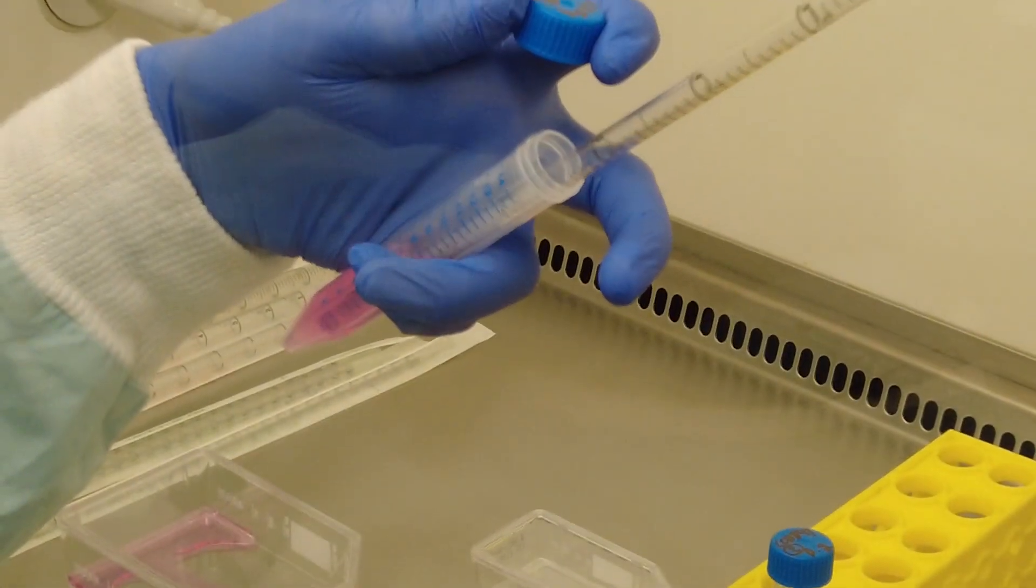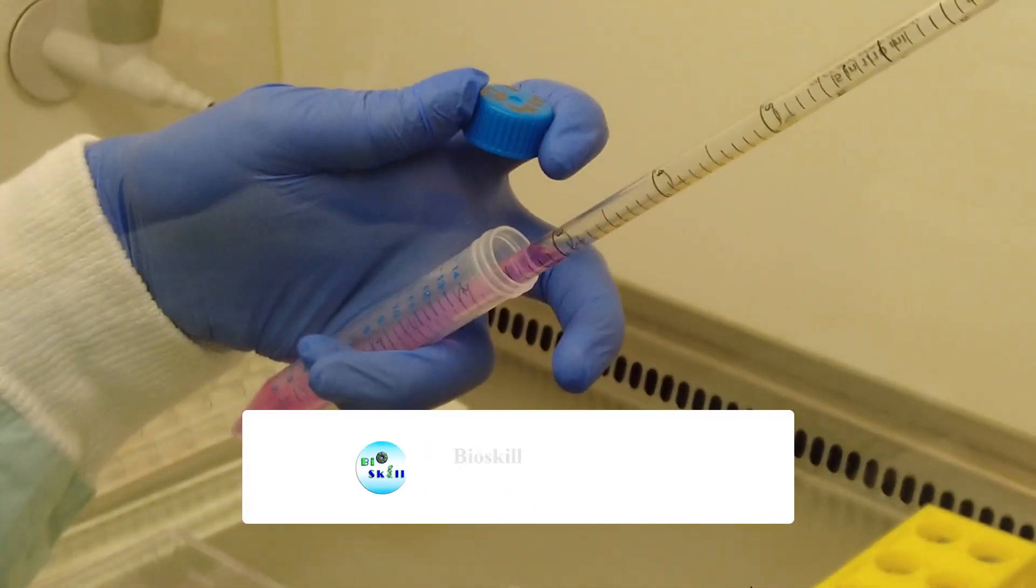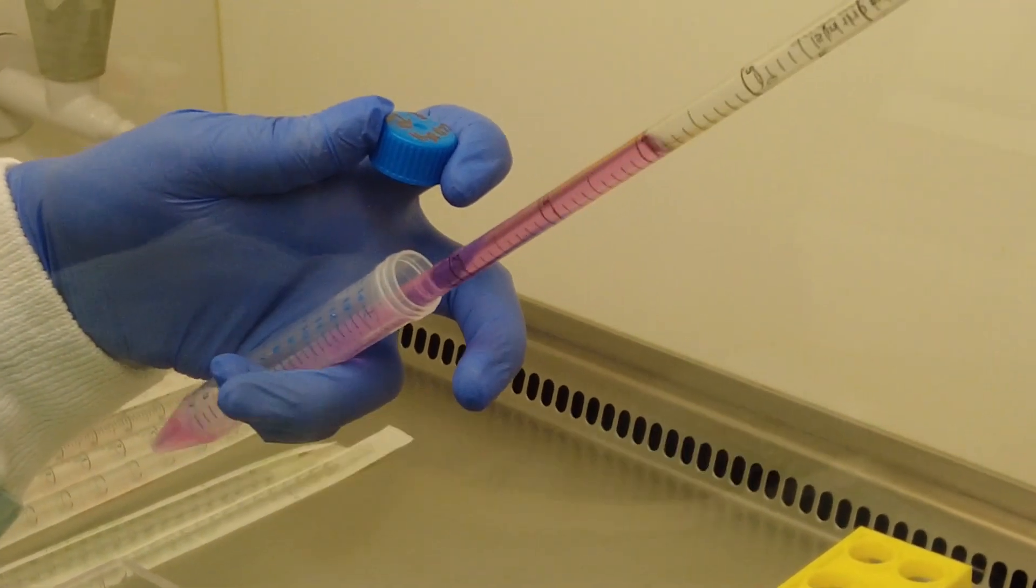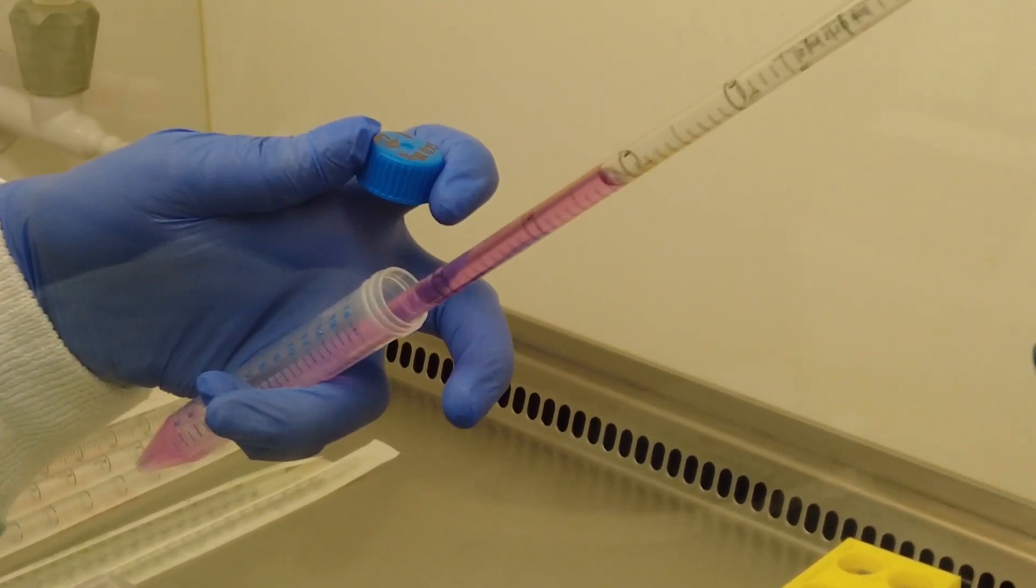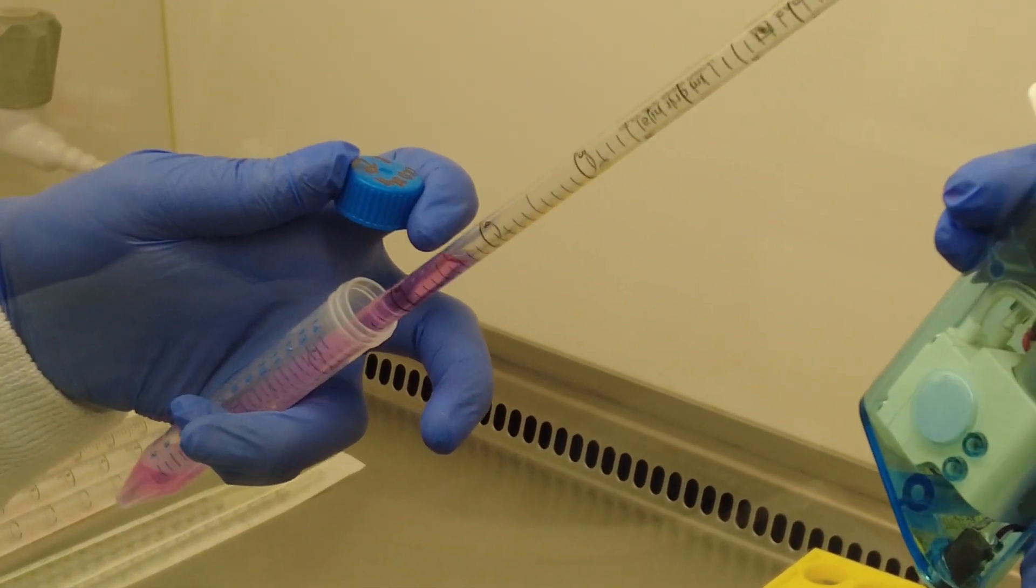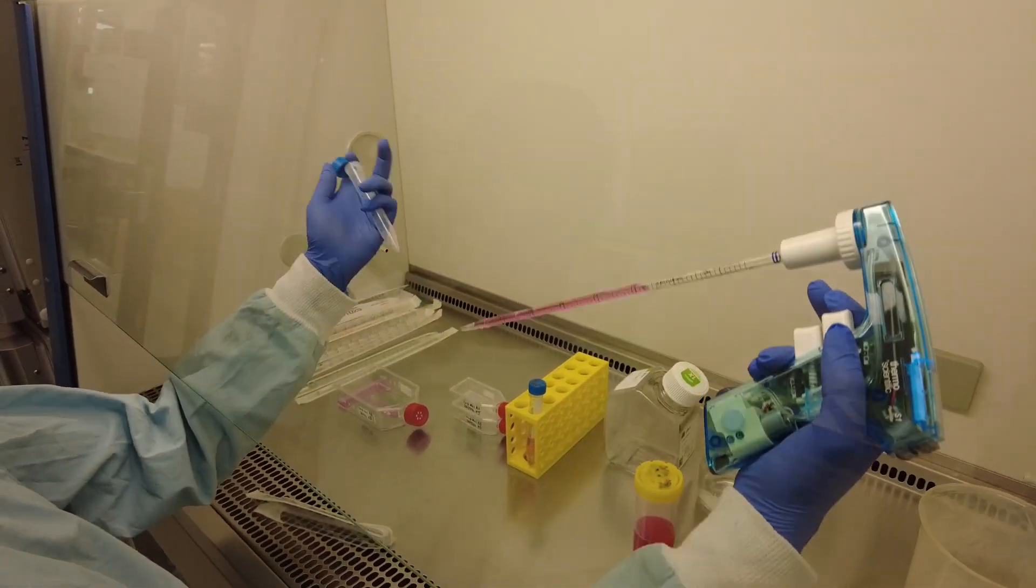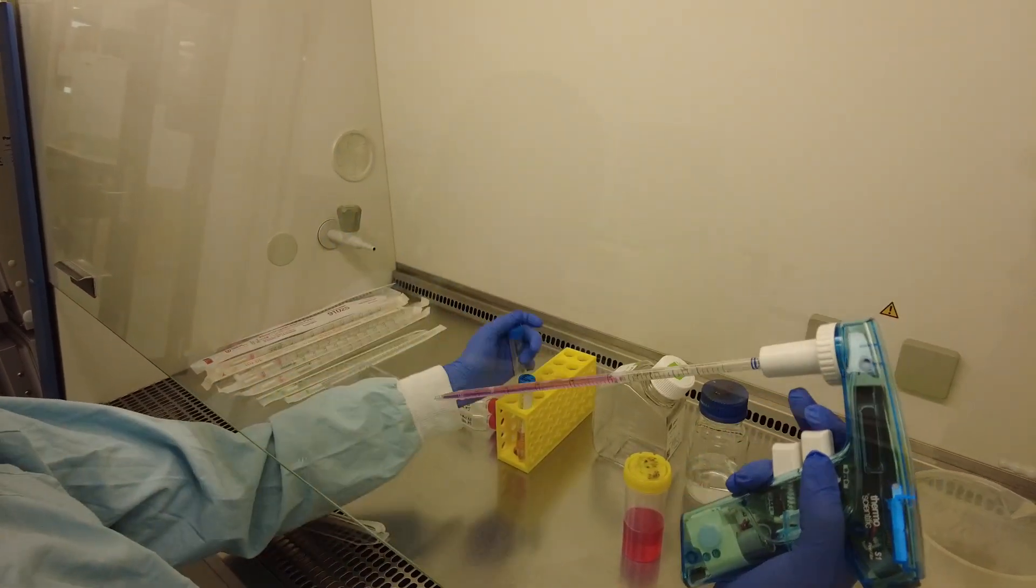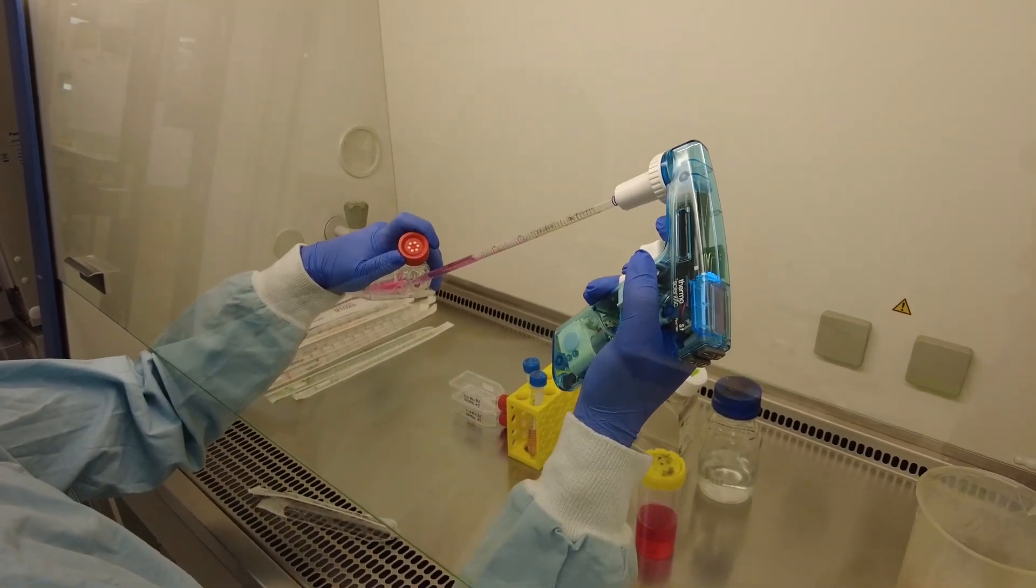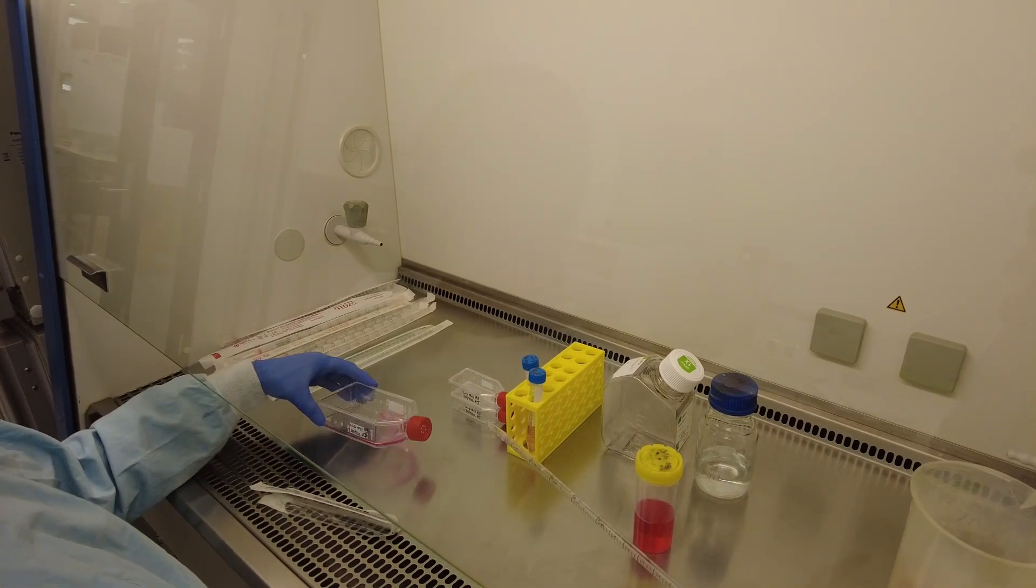Then we're going to add fresh media into the centrifuge tube. So we're going to pipette up and down just so we can disperse the pellet of cells. Collect everything out of the tube. That's the first one done.